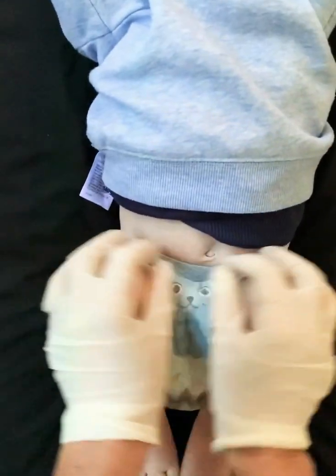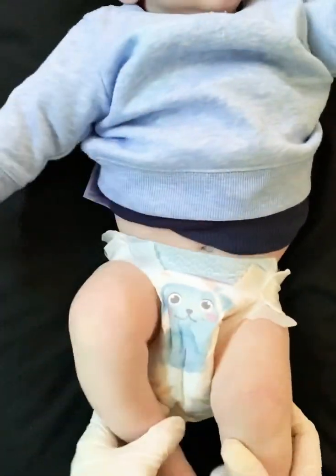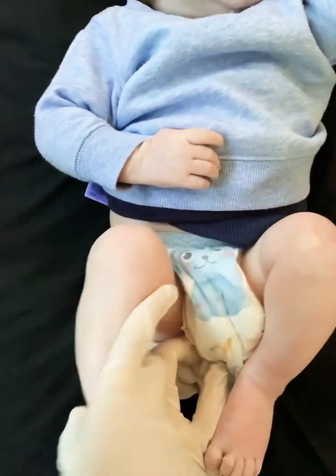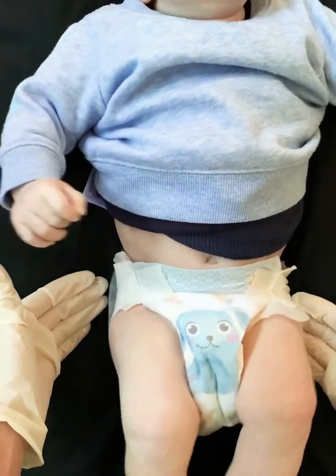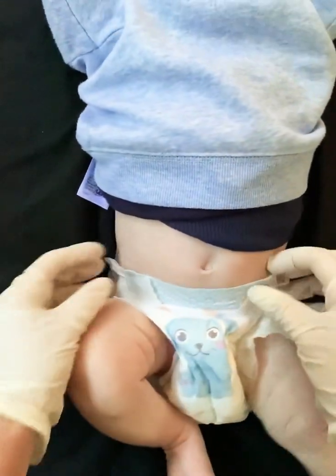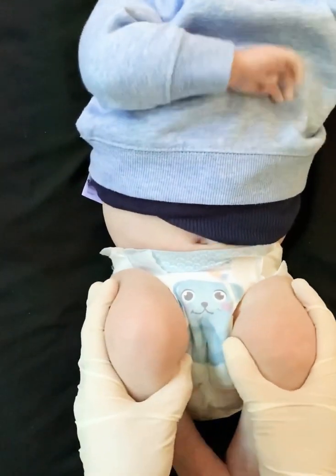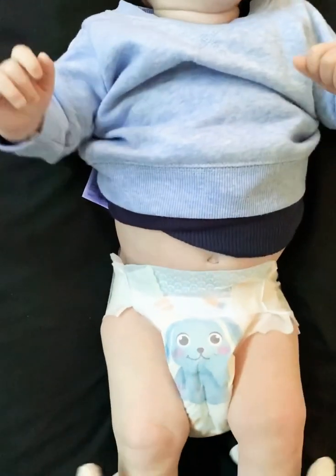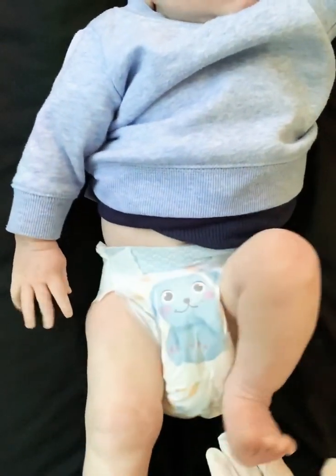The von Rosen brace brings the hips into a frog-leg position with handlebars coming up. If allowed to remove the brace, you can squeeze the handlebars together to get your view, or simply unhook the leg from the stirrup. The Pavlik harness is easier to scan in. It's important to learn to scan with the infant supine, as the HARKEY femoral head coverage test was developed and validated in the supine position. Graf does scan with the infant in decubitus using a brace, but since braces aren't available in most ultrasound departments, supine scanning is perfectly acceptable. Good luck with your scanning.